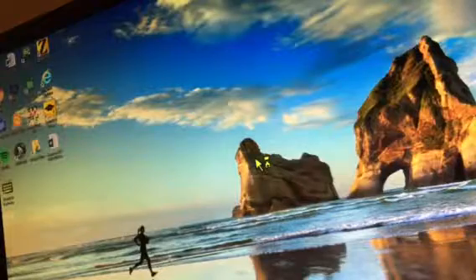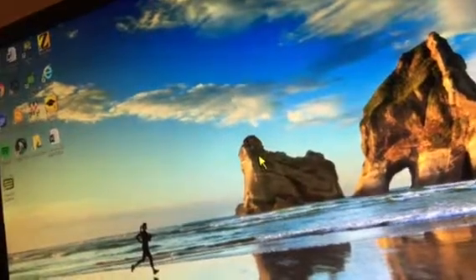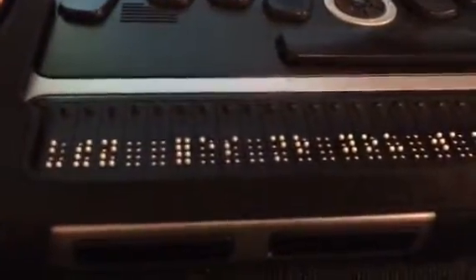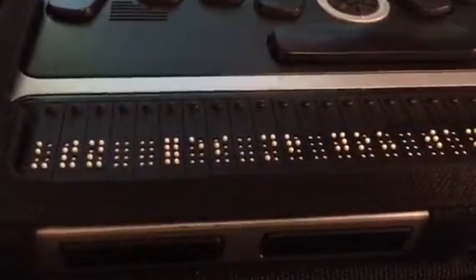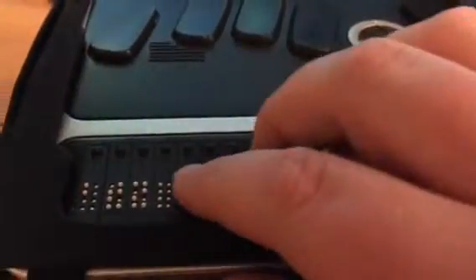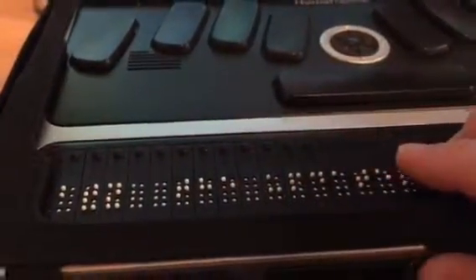JAWS Professional. Now every time I do anything on the screen, it says everything on the Apex, and it's in uncontracted Braille. I don't know why that is; I have to go and change that. But anyways, so that is how you connect it via Bluetooth to your Windows computer.